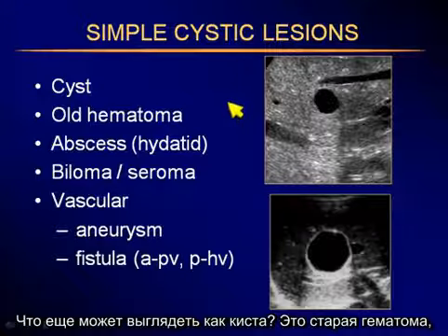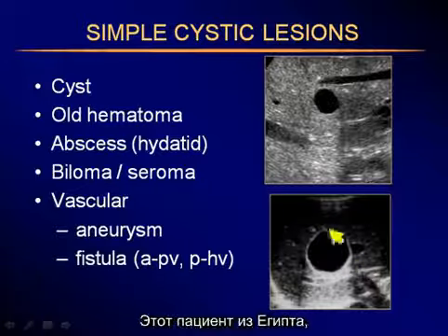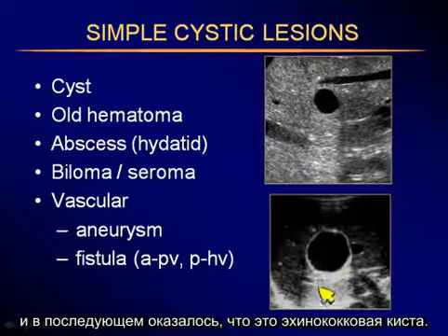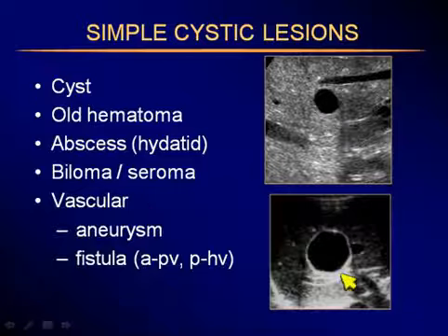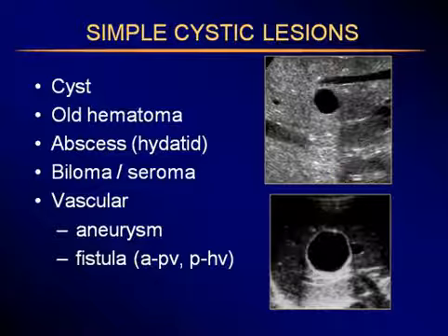Well, an old hematoma, a hydatid or echinococcal abscess, which this is. This is a patient from Egypt who had a solitary cyst, and eventually this was diagnosed to be echinococcal. A biloma or a seroma can look like a simple cyst.